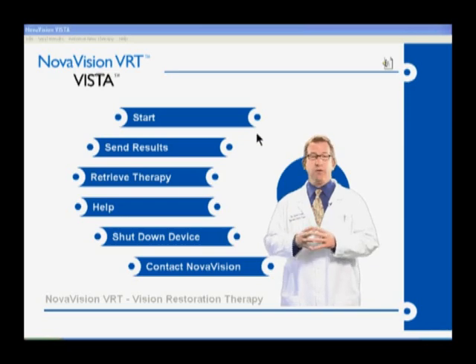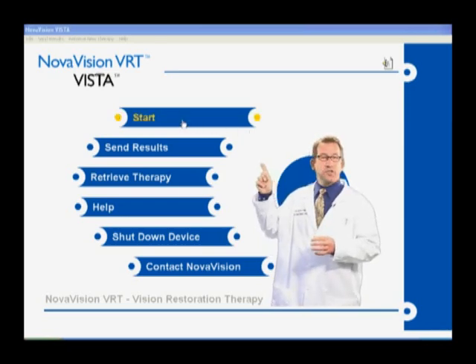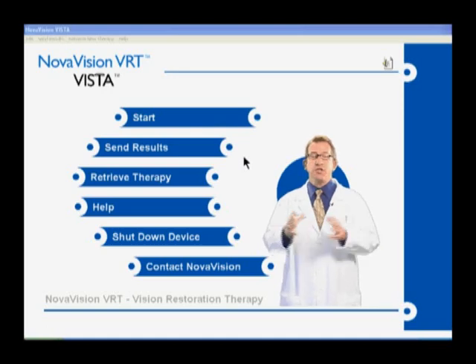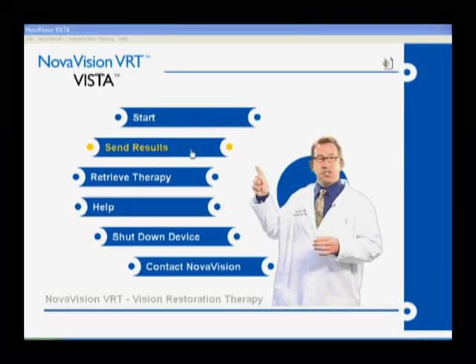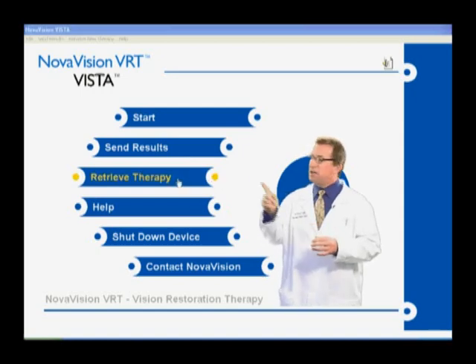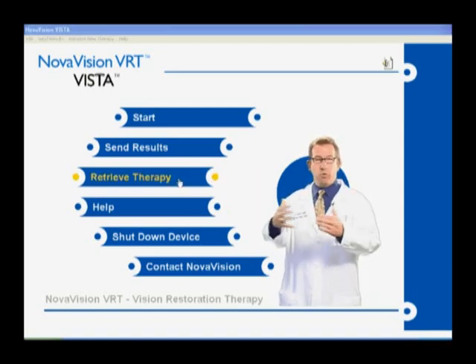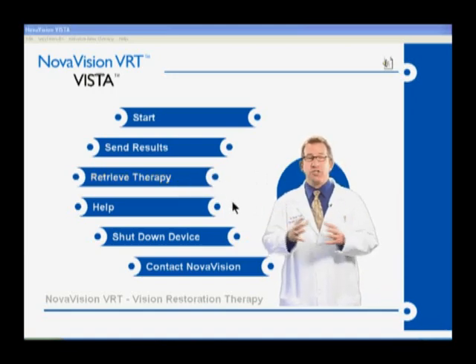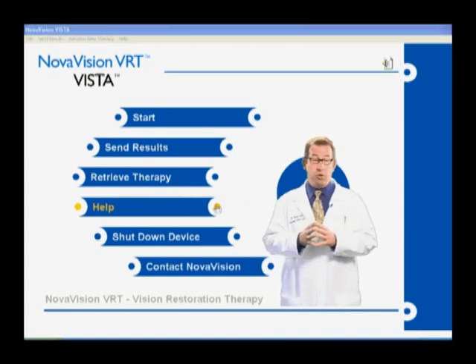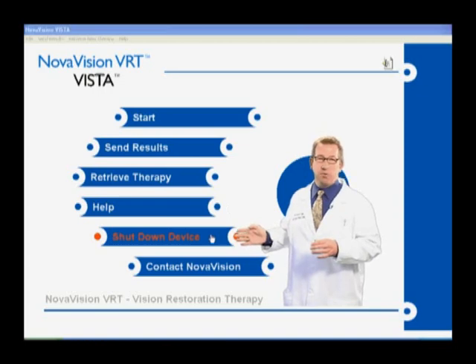Before you start your evaluation session today or VRT in general, it's important that you know how to navigate your way through the program. It's pretty easy. To start a session, simply hover over the start bar with your cursor and click it — your session will begin. If you've finished your diagnostic testing or a 30-day set of therapy modules, simply click on the send results bar and NovaVision will receive your data. If you're waiting for new therapy to arrive, simply hover over the retrieve therapy bar and your results will be downloaded to the device. If you need to shut down the device, simply hover over the shut down device bar and it will.